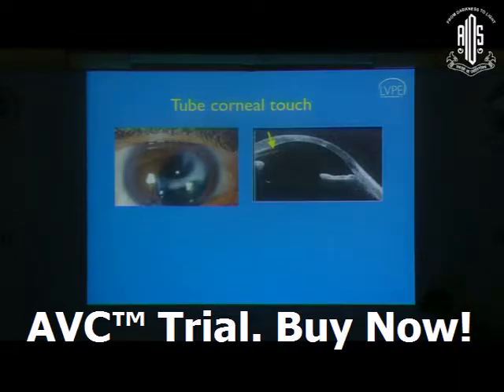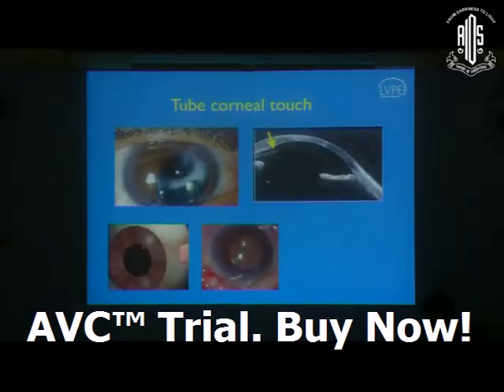habit of rubbing his eye, number one, which is more common in children. But secondly, once you develop, you can see actually in that OCT, you see the cornea is very thick here and quite thin here. Because of that, over a period of time, the cornea became so thick that it started coming towards the tube, and now there is a tube corneal contact, and he had a tube excision and redirection of the tube to make sure that at least we will limit the corneal edema in that place.